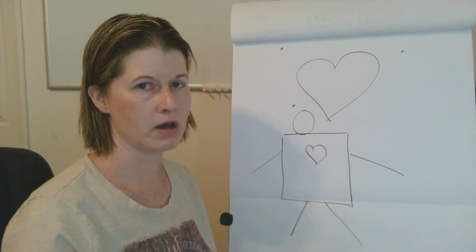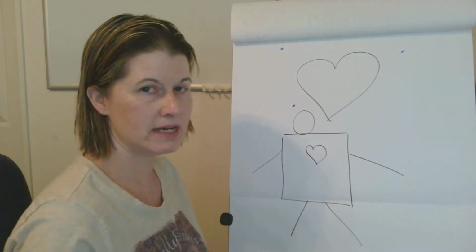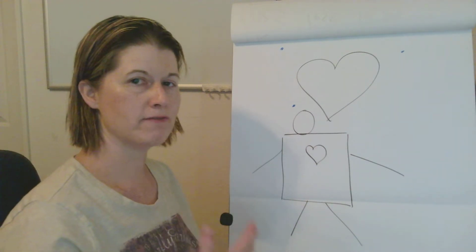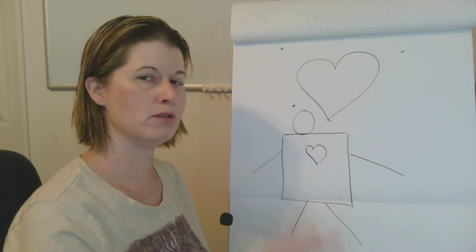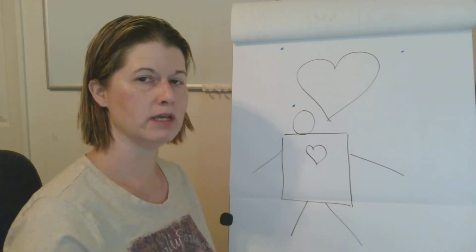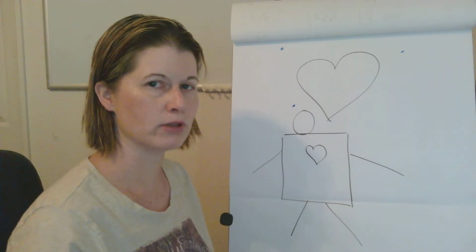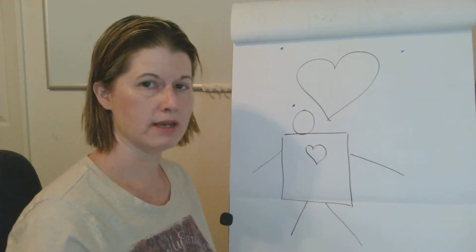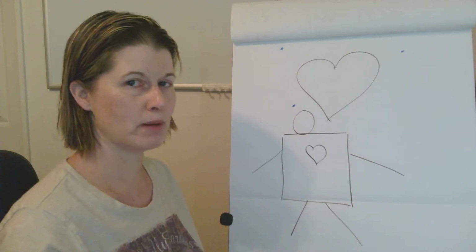You attach it to a wire that then attaches to the monitor. So the way that we do this, we have a mnemonic. Everybody does it a little bit differently. I'm going to teach you the way that I know. So whether you have 3 leads or 6 leads, you either have 3, 5, or 6. We don't generally see 12 lead on a regular tele floor. So 12 lead we're going to leave for a later time. So we're going to say white is right. That's where you're going to start because it rhymes. It's cute. Okay, it's easy to remember.